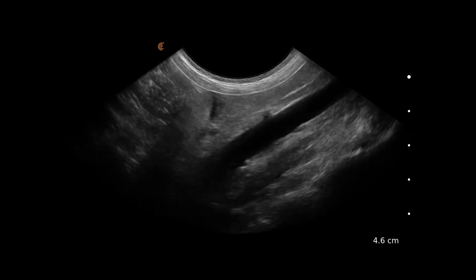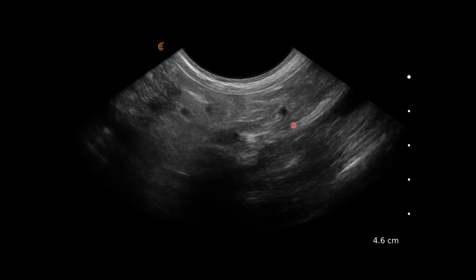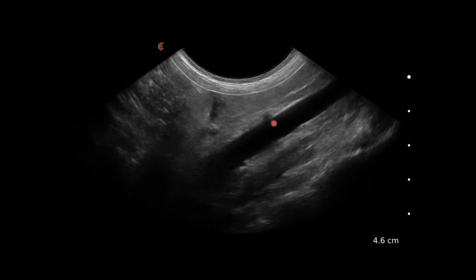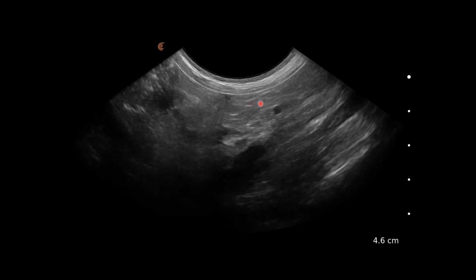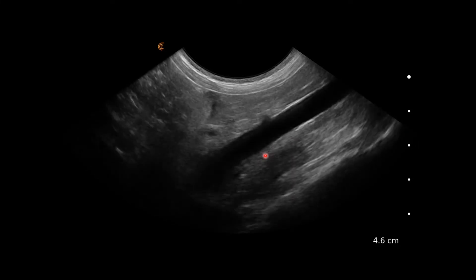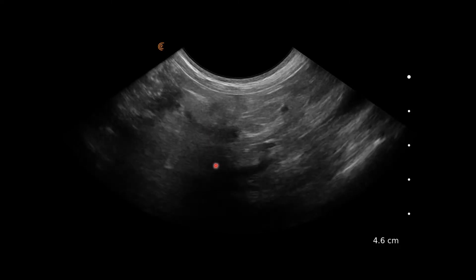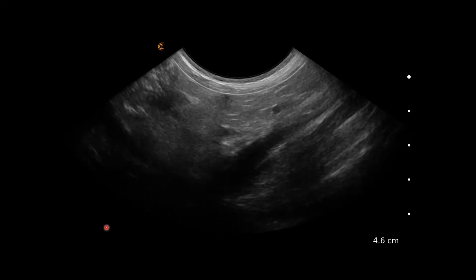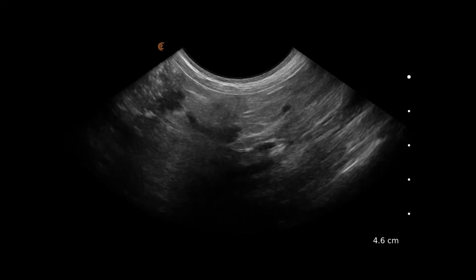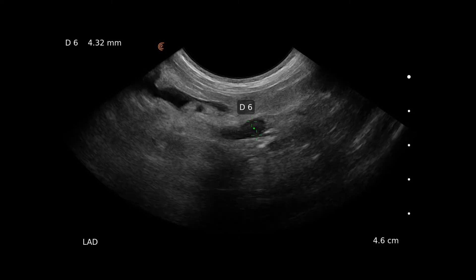Now we're following the aorta cranially. We can see the renal artery leaving the aorta here, so we know we're in the region of the left adrenal. Here we have the left adrenal with the cranial pole and the caudal pole. We can see pockets of free fluid in these images too.